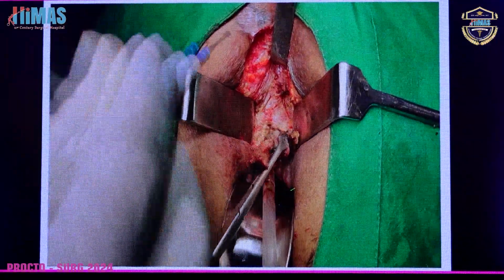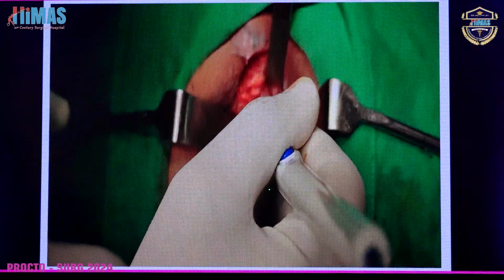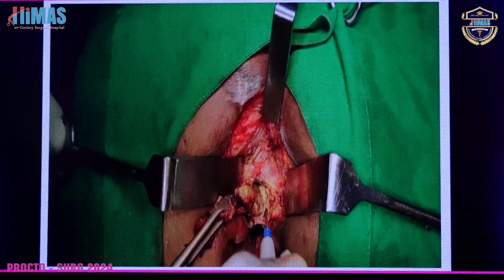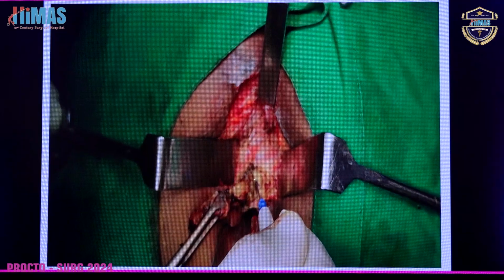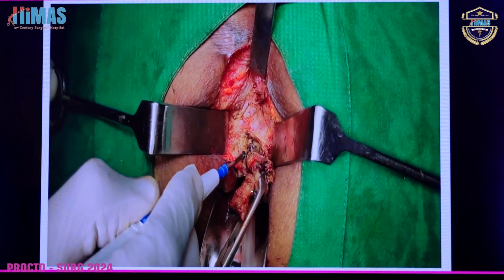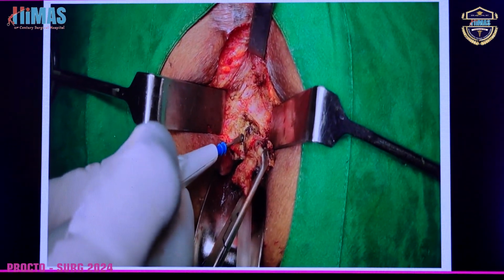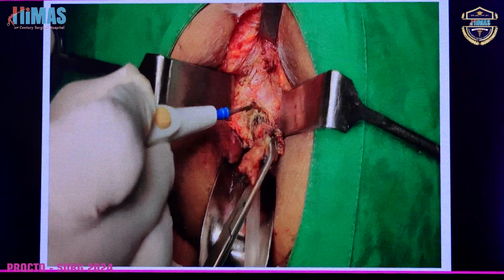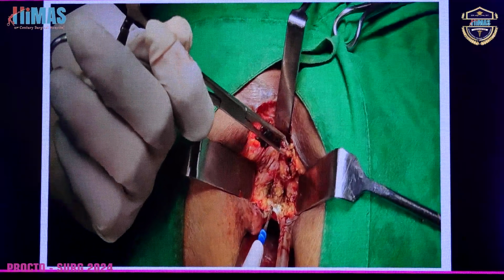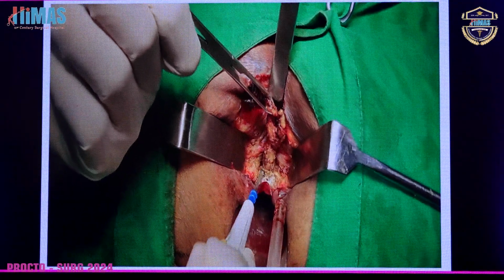Whenever we are doing any fistula surgery, when we are unsure of how much muscle we are about to divide or how much we have divided, we should palpate the anorectal ring inside. So we are taking it out, and it is almost completely out now. If you are near to it, there is very less bleeding. As you can see over here, it will not bleed, and you can do it in a good field. You can see we are taking it out.